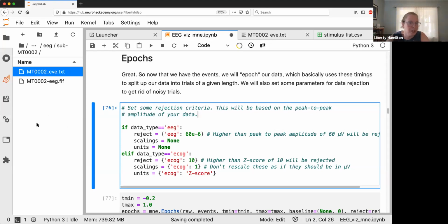All right, I see a question from Andrew. Is there a way to be specific with epoching using response time limitations, or only epoching certain trials that are followed or preceded by other specific trial types? That's a very good question. I can't think of a way that is doable automatically with MNE. You certainly could do that with Python.